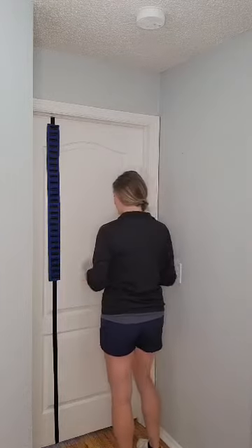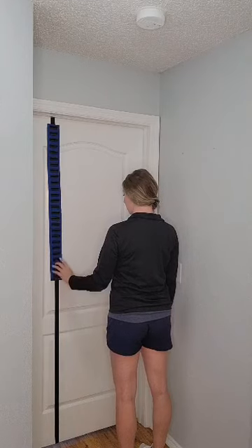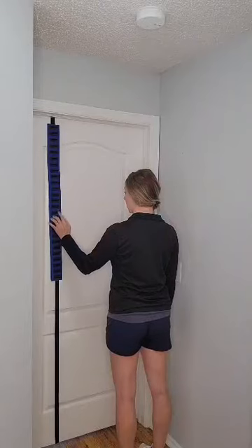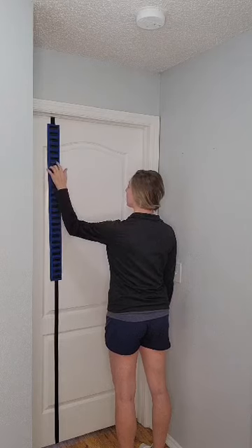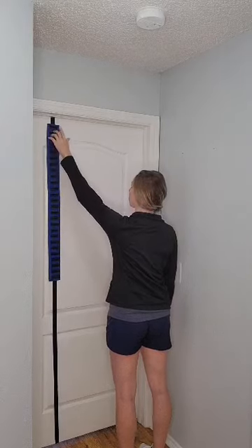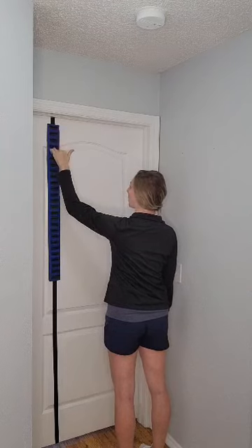Now, I'm going to start on the bottom rung and making sure my shoulders stay down and back. I'm going to slowly start crawling up the ladder. You want to make sure that your elbow does not try to hike to the side, that it stays in line, and that the shoulder stays down in a nice position versus hiking up, which is a common compensation. Once you get all the way to the top, if you can hold for 5 seconds, fantastic, but just do what you can. And then slowly work your way down.